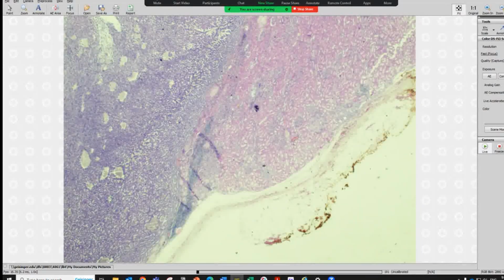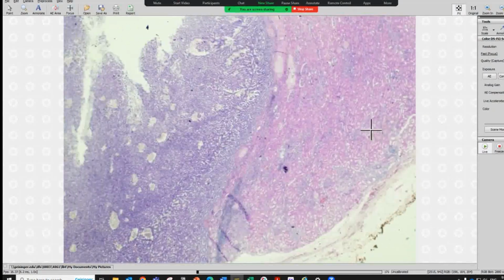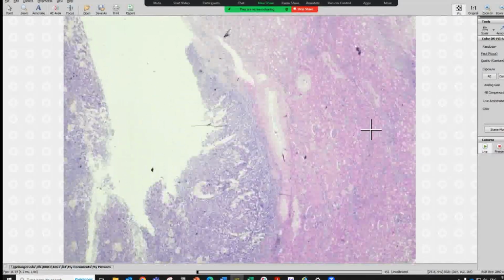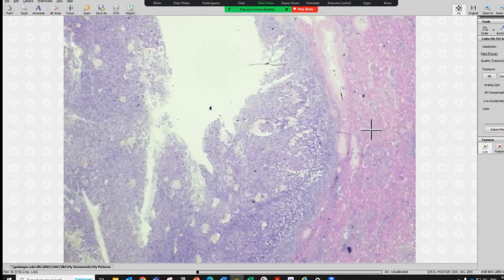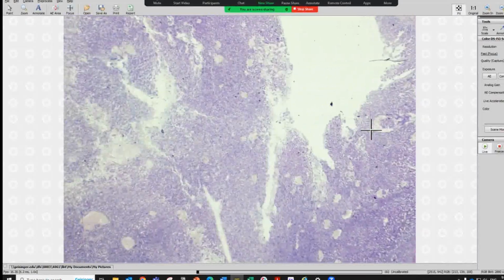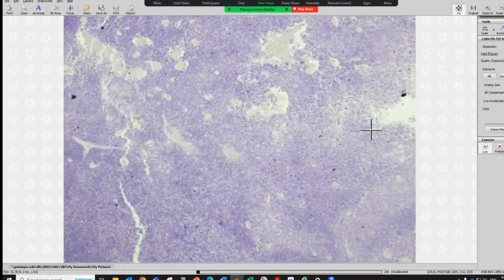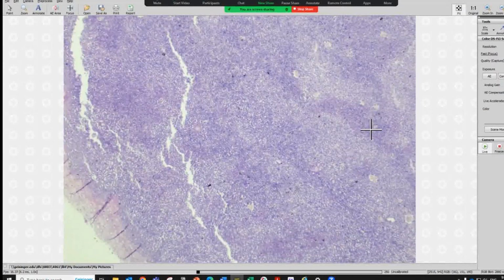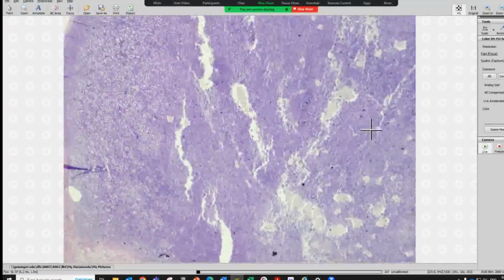And I can tell you this is the normal size of the glomeruli. So this is also from an adult. And we can also see a well demarcated border between the lesion and our normal kidney. And then here we can see papillary structure, really minimum stroma. And then here we can see more tubules forming. So this is another metanephric adenoma.